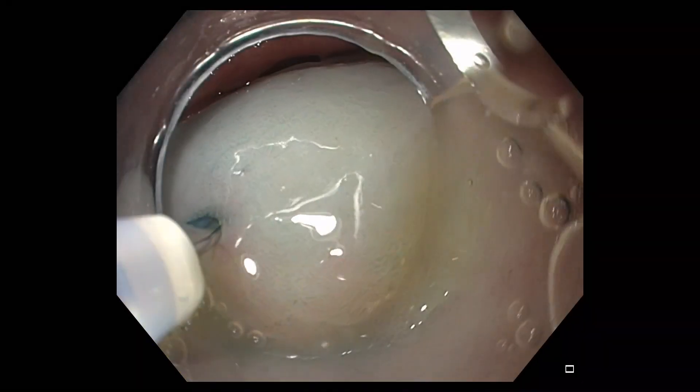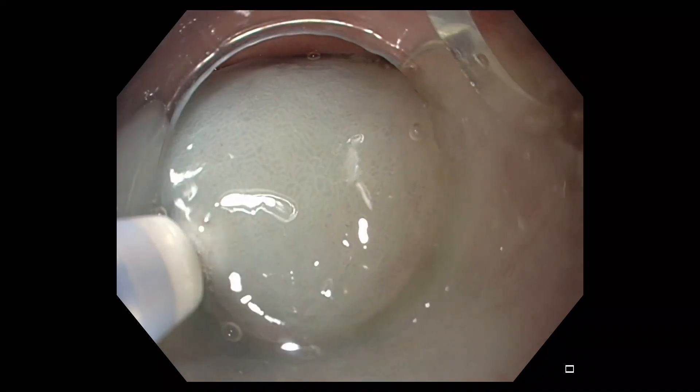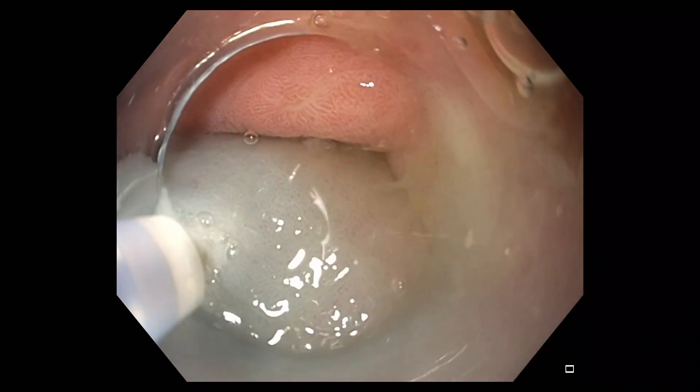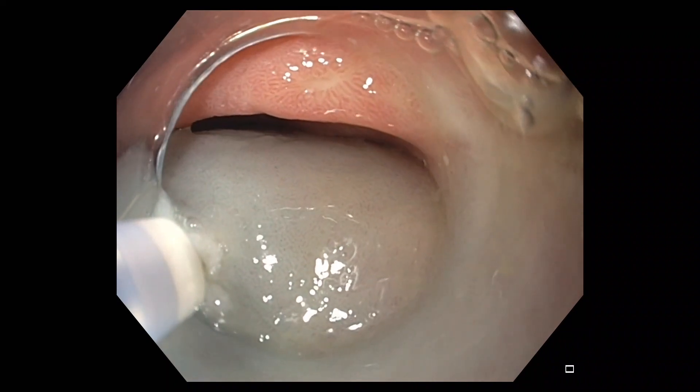Following injection of 10 cc's of saline to create a submucosal lift, the triangle tip J knife is used to create a two centimeter long mucosal incision. The mucosal incision is created using blended current.